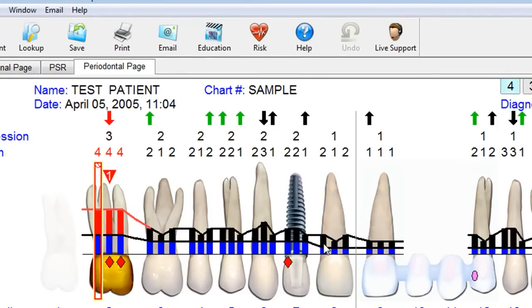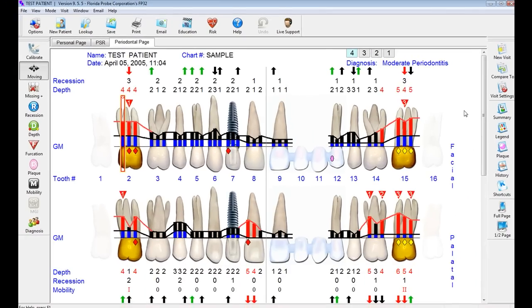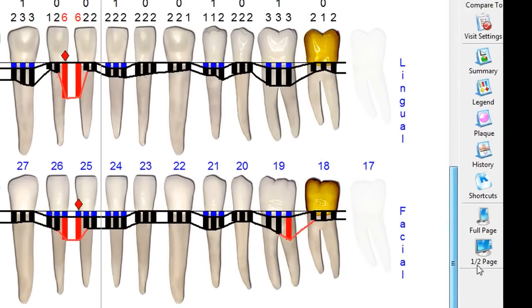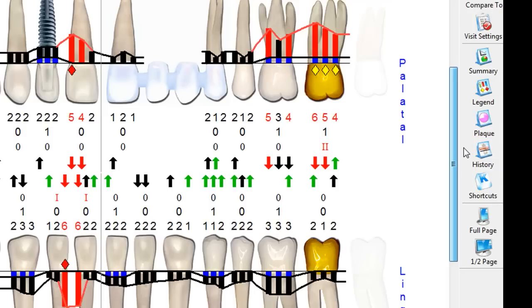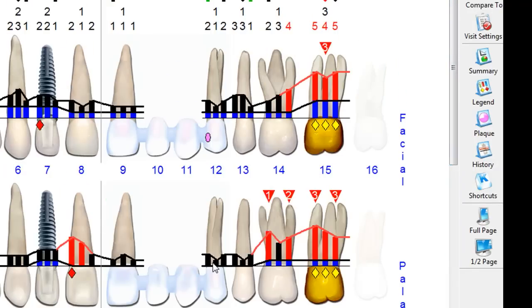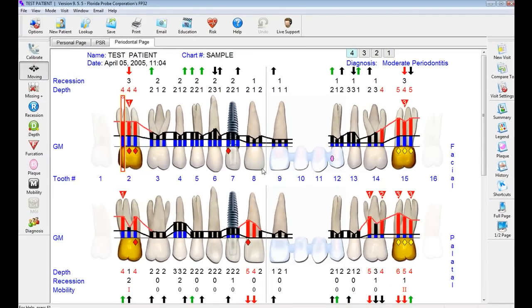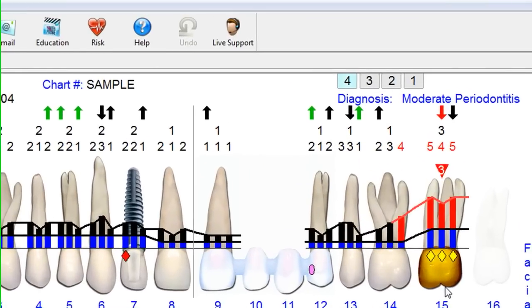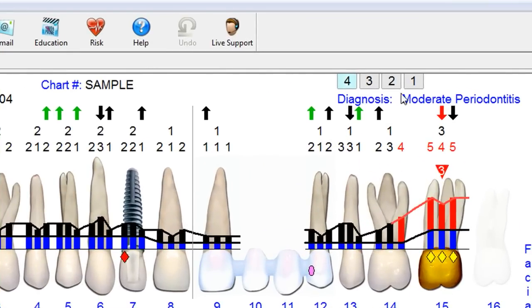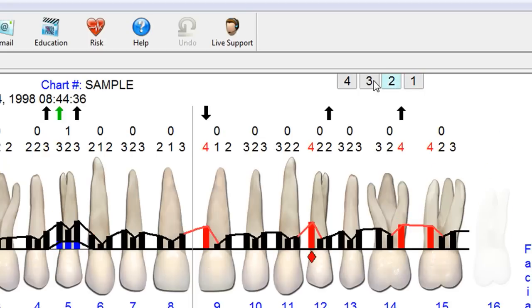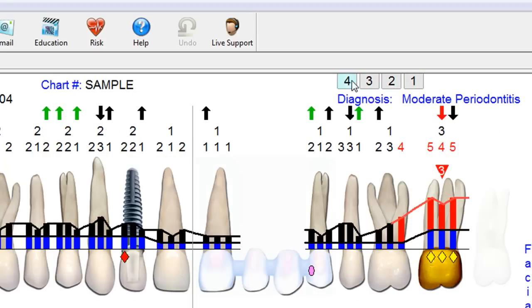You are in the moving mode. It allows us to start in the moving mode where we can move around the mouth and see the entire chart. You can see that we show both the facial and lingual surface of each tooth. The teeth numbers are listed here in the center of the chart. This particular patient has four different visits, so you can instantly flip between all four visits.